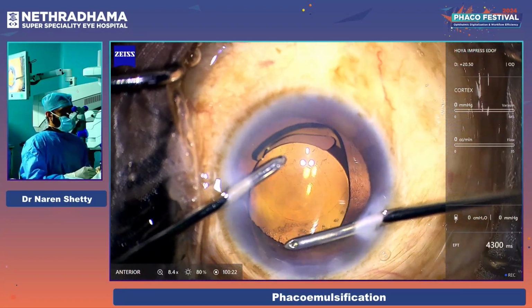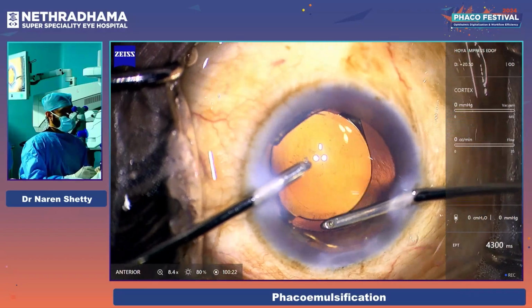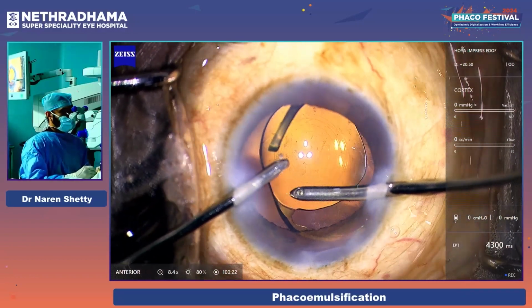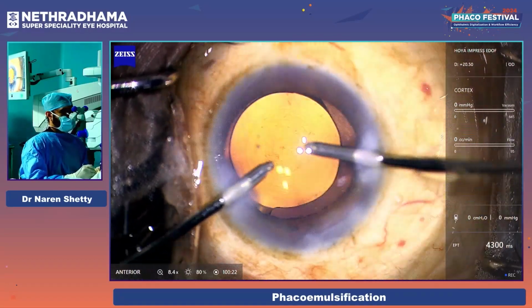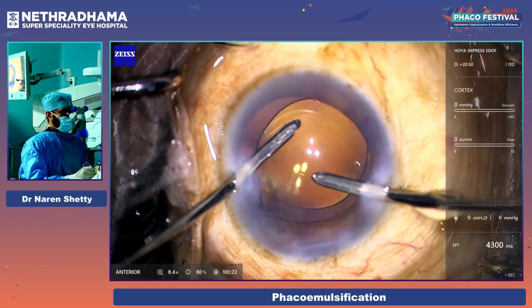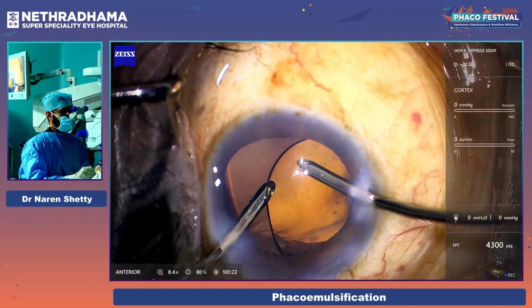If you see, don't push the IOL directly down. Try to hold the edge of it. Okay? Push it towards the center, so that you don't push on the iris and the patient doesn't have pain, and you don't disturb the iris too much, because it leads to more prostaglandin release if you disturb the iris too much.